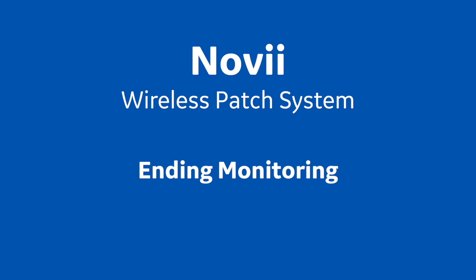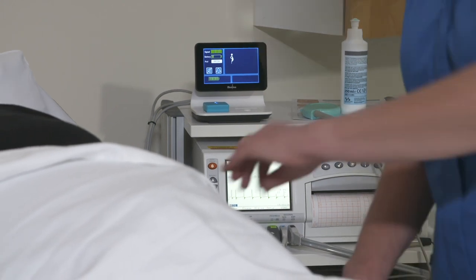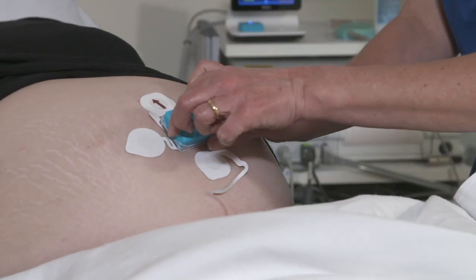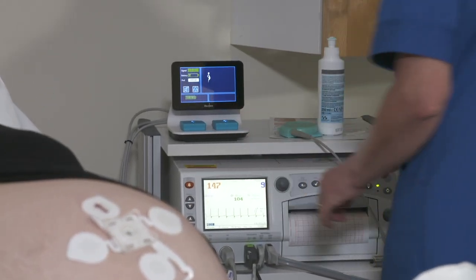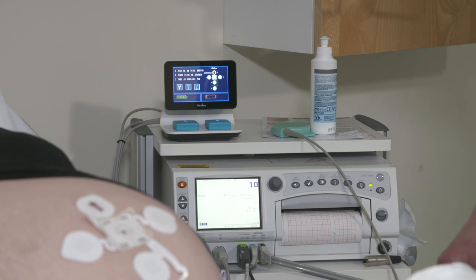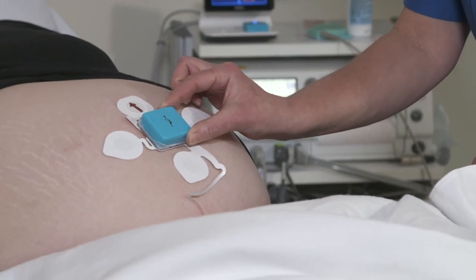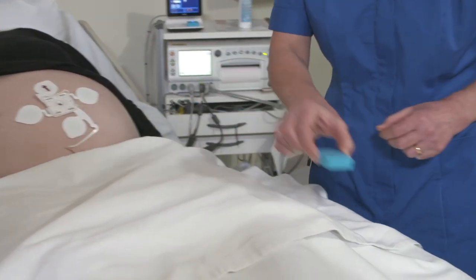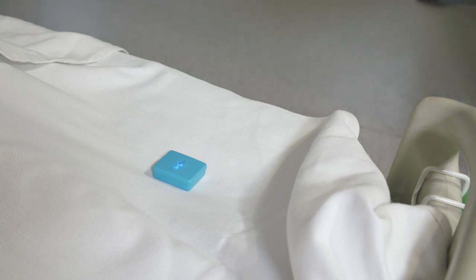Training Session 9: Ending Monitoring. When you want to end the monitoring session, either because the baby has delivered or is about to deliver, or because the pod battery is nearly empty, simply remove the pod from the patch and place it back into the empty charging bay — this will end the monitoring session. If you want to continue monitoring, wait a few seconds for the interface to return to the start screen, as taking the charged pod too soon will result in the pod turning off. It is very important that you always return the pod to the charging bay on the Novi interface, even if you have not had time to clean it. Leaving a pod on the bed or putting it to one side may result in losing the pod.